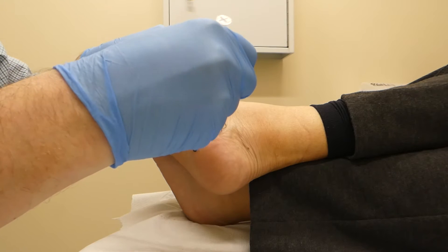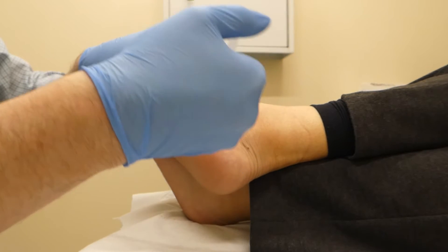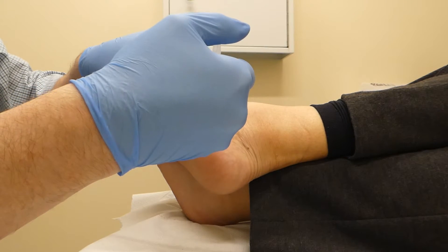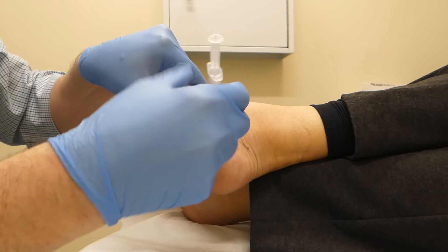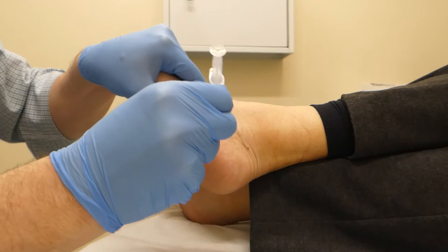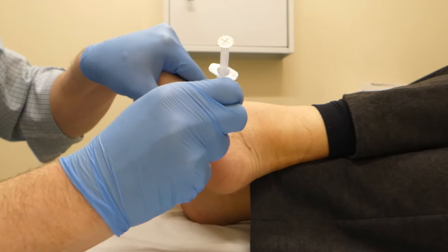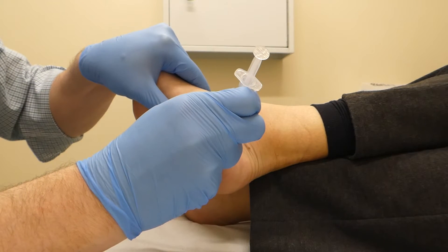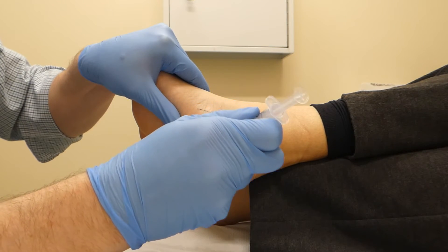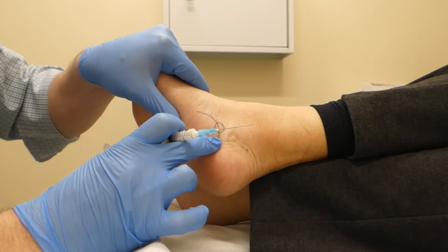So there? Yes. If you could see Nicky's face — she says thank you very much. Just feel that. Sorry Nicky. A little scratch there, and then we'll see how much claret we get. There's a tiny, tiny bit of claret just there.